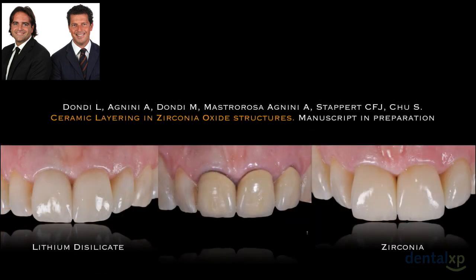And here you can see that for the same case we did another set of crowns in lithium disilicate, because this case is inside a study that we are doing together with Dr. Steve Chu from Columbia University, New York, and Dr. Christian Stappert from University of Maryland, where we are evaluating and describing the ceramic layering in zirconia oxide structures.